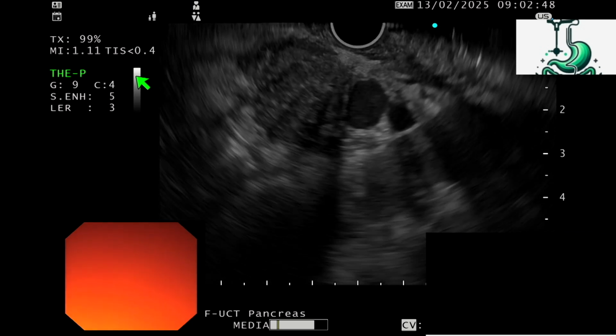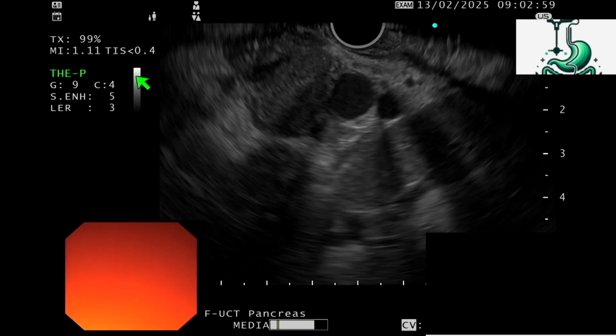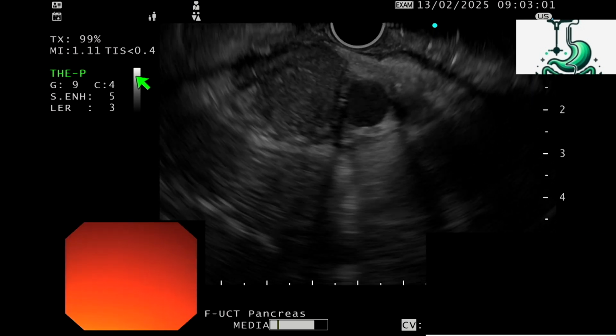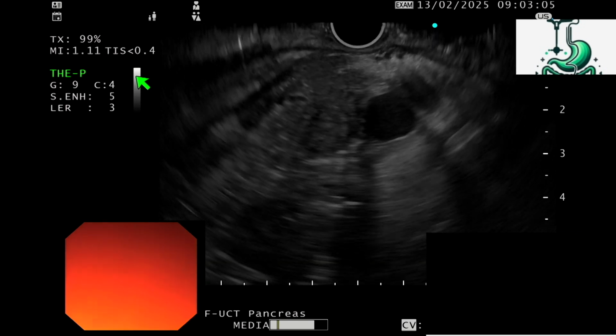Are those calcifications, Dr. Mohan, recent calcifications in the parenchyma? There are no calcifications, and I'm just concentrating on the duct morphology, because in a case of obstructive jaundice, if you have a pancreatic head pathology, you will have a diffuse ductal dilatation in case of malignancy.